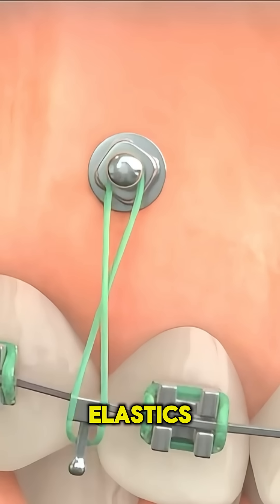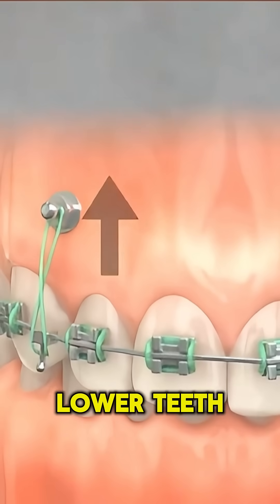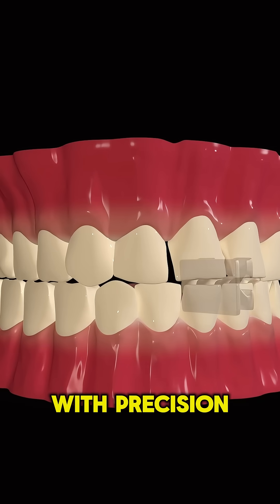Rubber bands or elastics add extra pressure to correct bite problems, helping the upper and lower teeth align perfectly. As weeks pass, the orthodontist adjusts the wire to continue shaping your smile with precision.